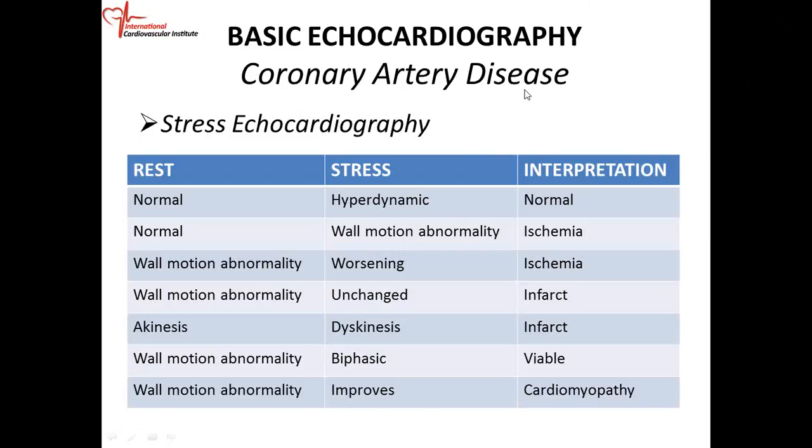So when you do your stress echo, if at rest on the echo, all the walls are normal. There's no wall motion abnormality, and you do your stress test.